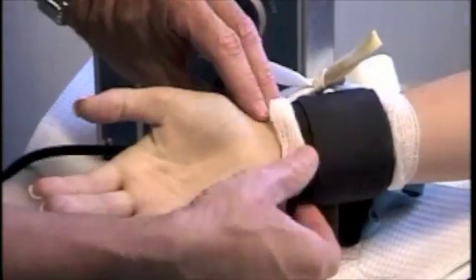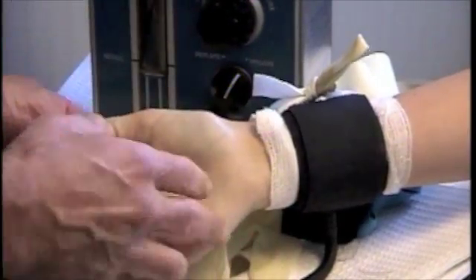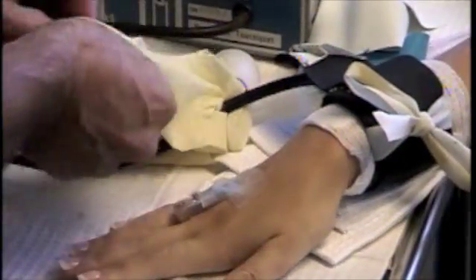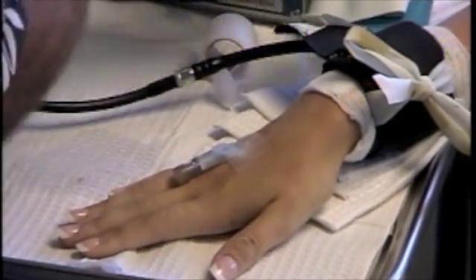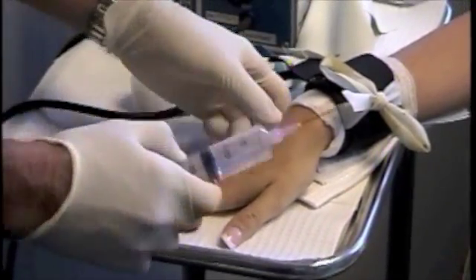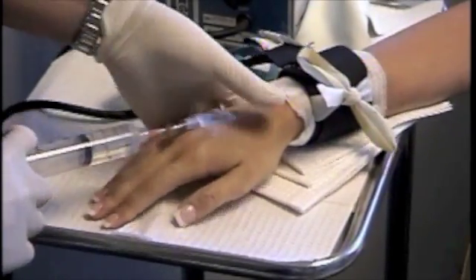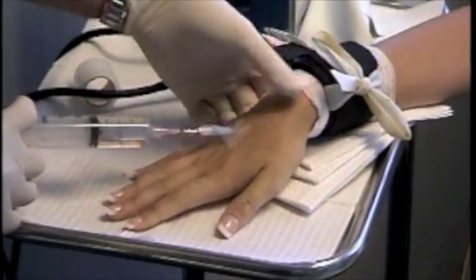I feel the pulse to make sure there is none, confirming the tourniquet is preventing any blood from going through her hand. I'll also be testing her fingernails to make sure there's no blood — checking that the capillary refill, the little blood vessels in the fingernails, don't fill with blood from the hand itself. What I'll be doing now is injecting xylocaine — half percent xylocaine, a very safe amount — approximately 14 to 16 cc's very slowly through the intravenous via a 22-gauge needle, a very small intravenous, into her hand.